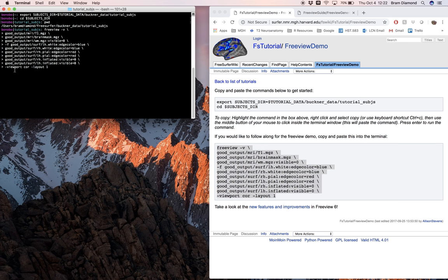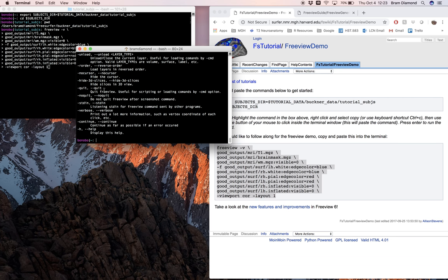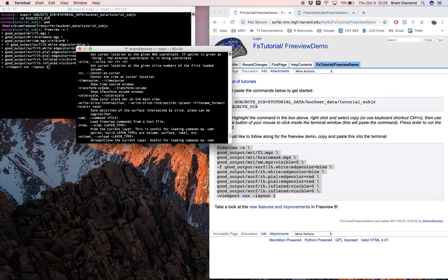After that we have viewport and layout. These are just ways of customizing the way that FreeView opens. Viewport will specify the predominant orientation — in this case, coronal. Layout specifies what viewing layout will load — in this case, one, which is a one-by-one square. All these arguments can be manually set within FreeView, but this will speed things up. In the future you can type 'freeview --help' and press enter to see all the different arguments and parameters.